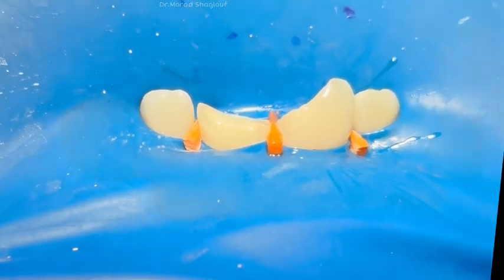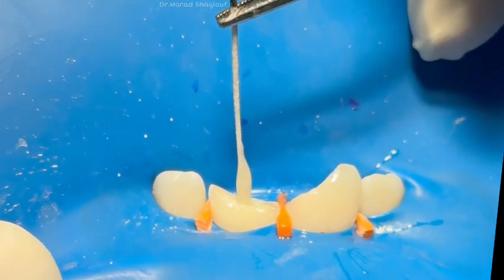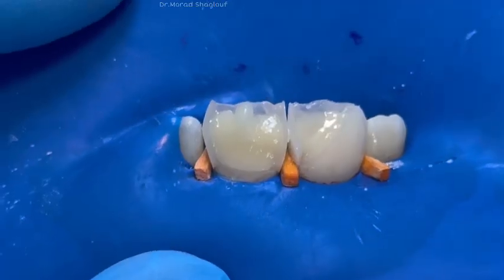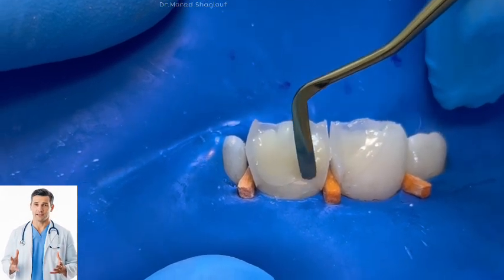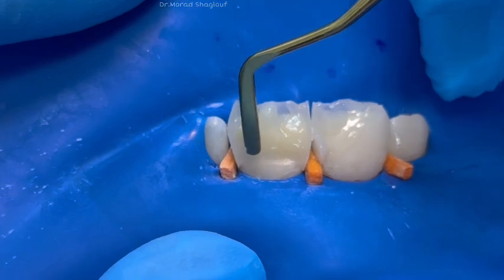Fiber post restorations allow clinicians to preserve remaining tooth structure while providing long-term support. When performed correctly, this technique can significantly improve both function and patient confidence.